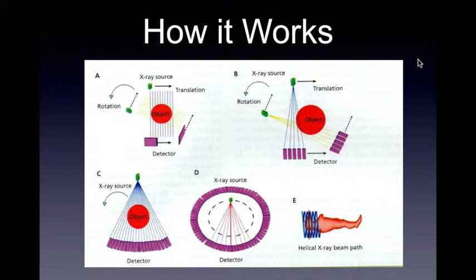Remember our panoramic radiograph? It was revolutionary at that time when we had the ability to stretch the entire jaw and get a panoramic view of it. That was possible when we utilized the X-ray and allowed it to move around the patient's head. Now, that then was utilized in order to get, well, a panoramic view of your patient.